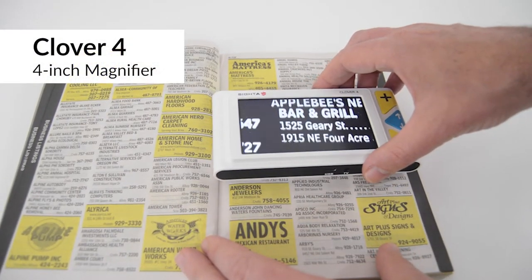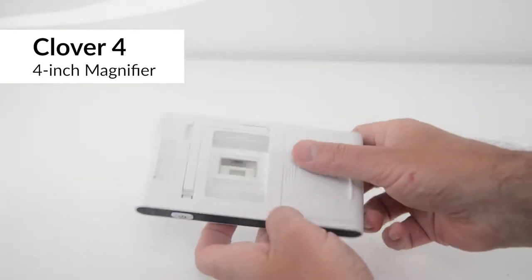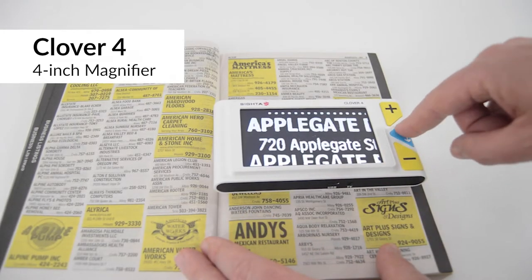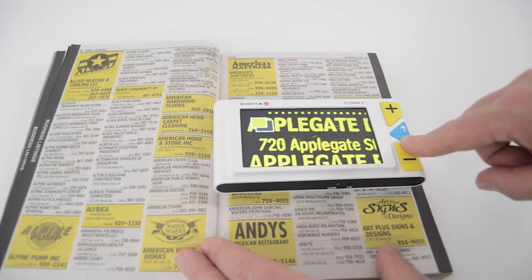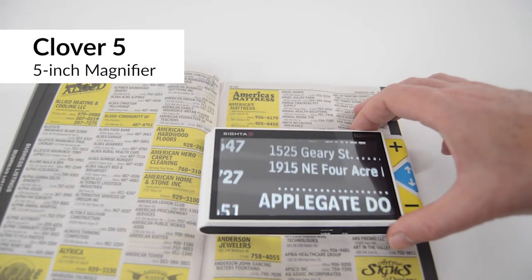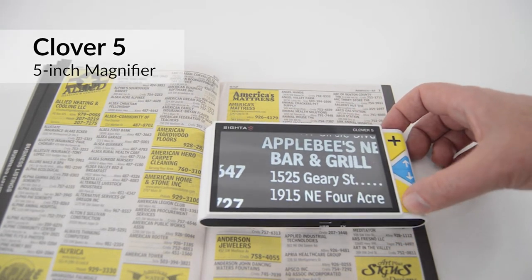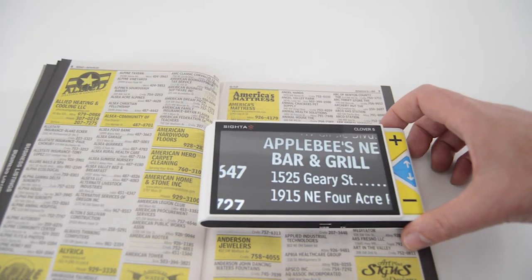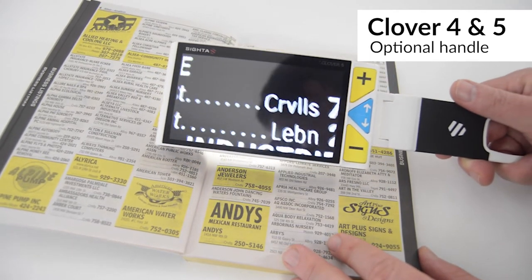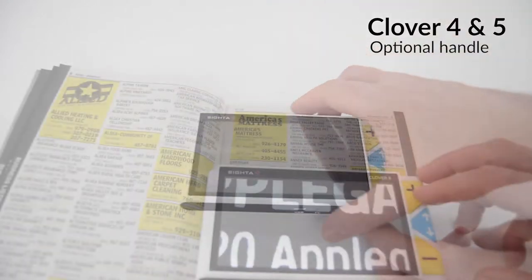Clover 4 gives you more screen space while still weighing only 7 ounces, and people love that Clover 4 has a user rechargeable and user replaceable battery. Check out Clover 4 if you need an affordable and very portable handheld magnifier. Clover 5 gives you even more screen space and still weighs less than 8 ounces. Clover 5 also has a user rechargeable, user replaceable battery, and a simple easy to use design. Both Clover 4 and Clover 5 have an optional extension handle, so they can be used like a magnifying glass — hold it in your hand, or fold the handle to read flat on the desk.